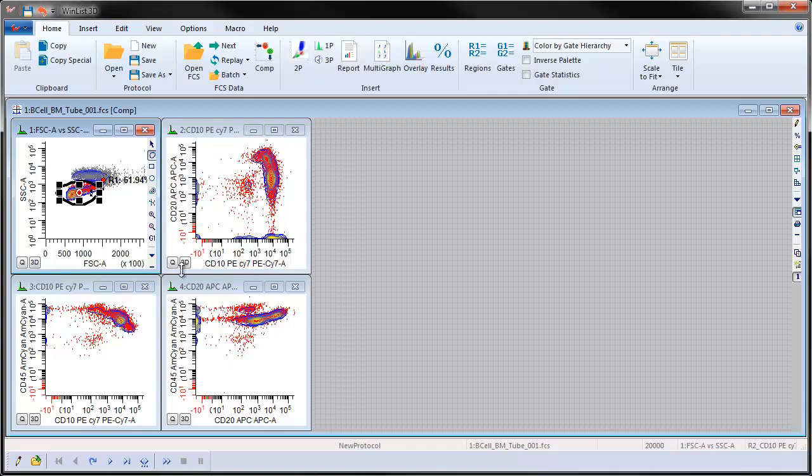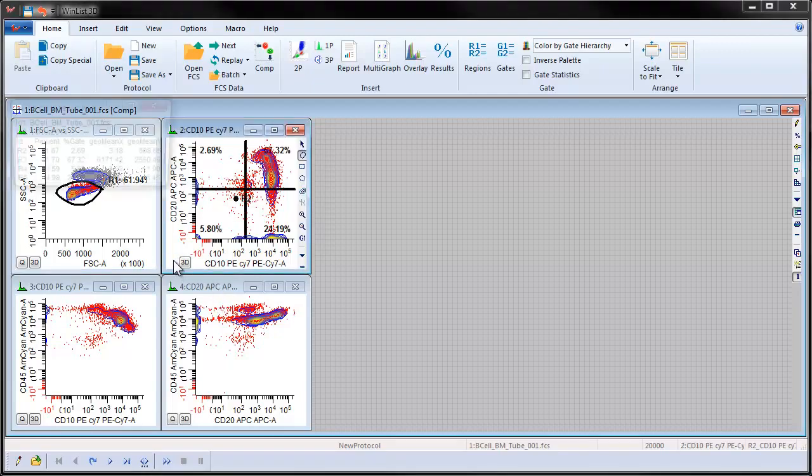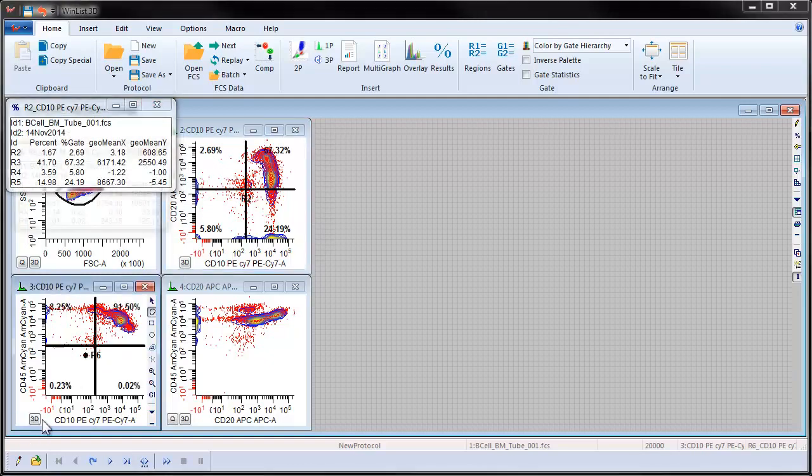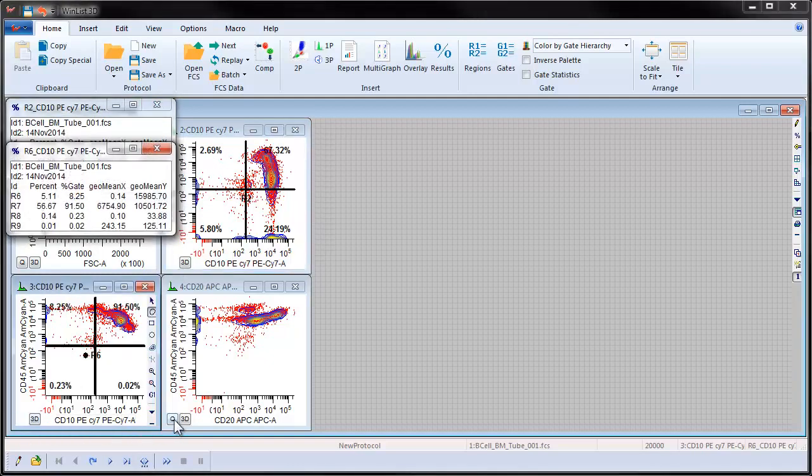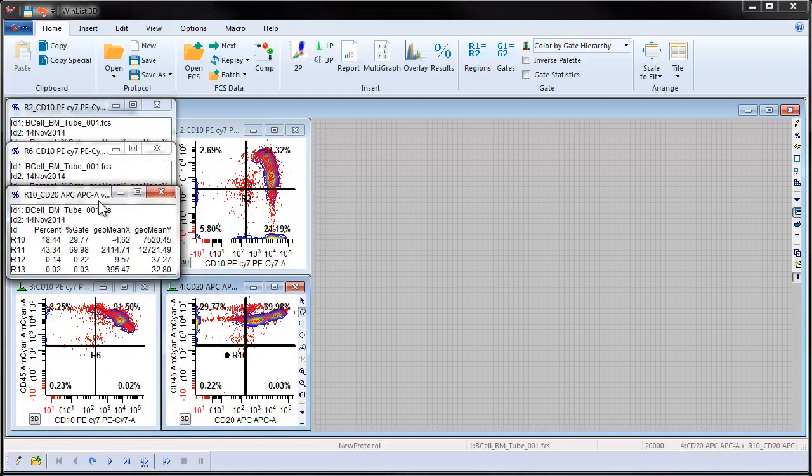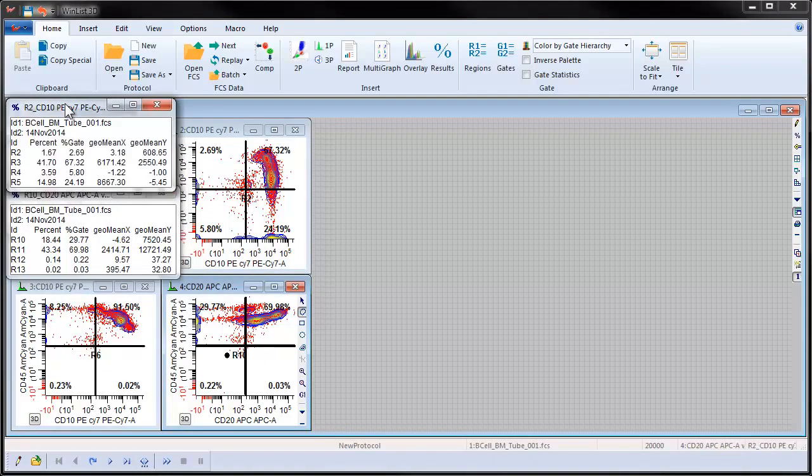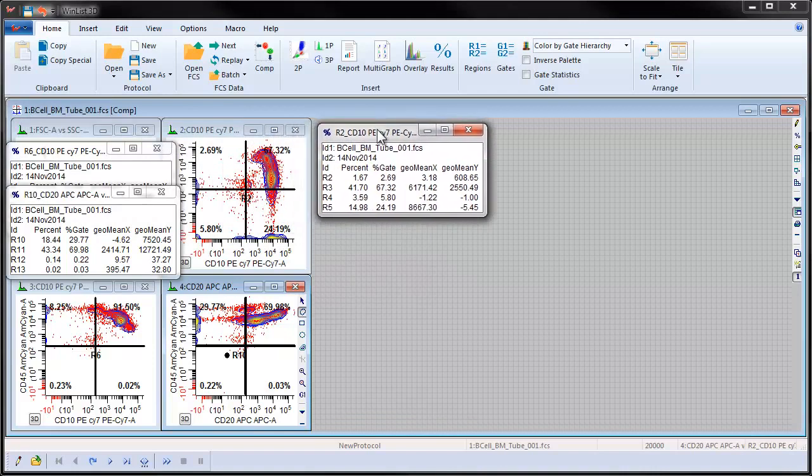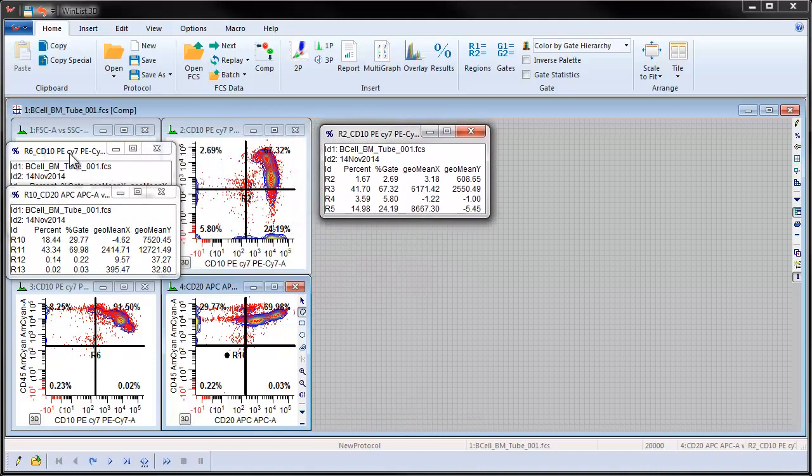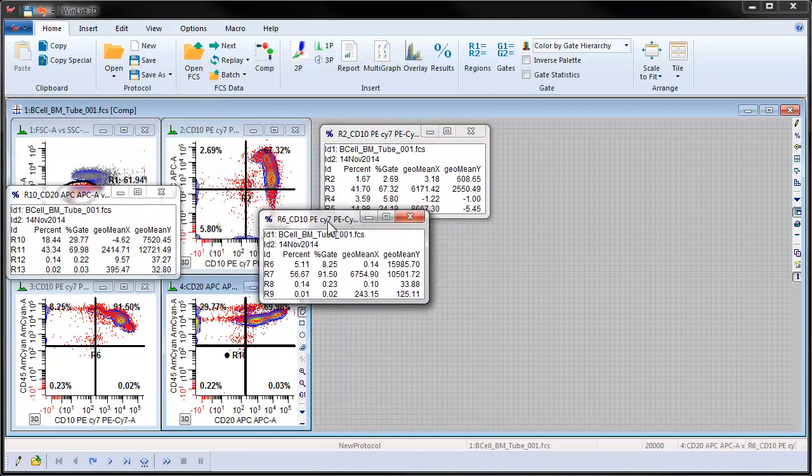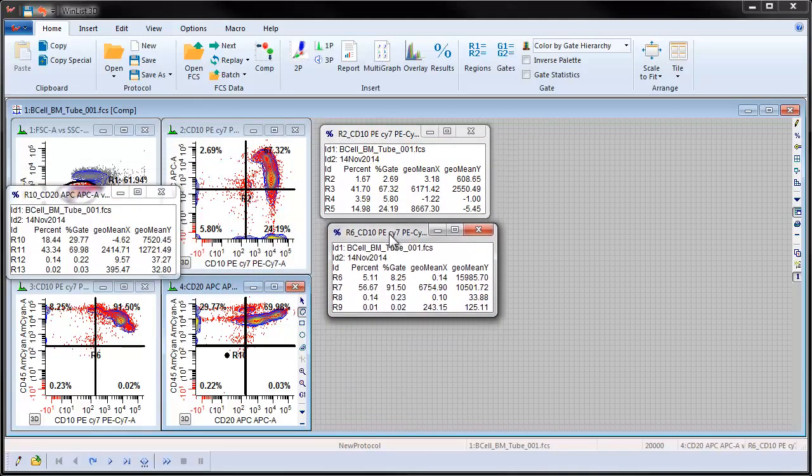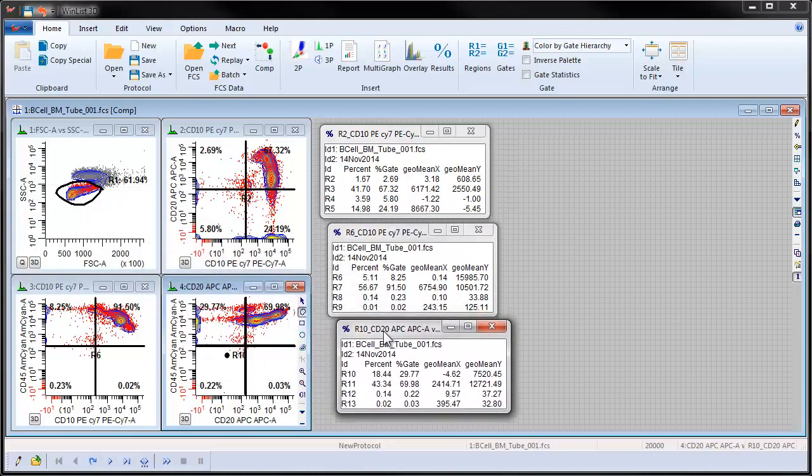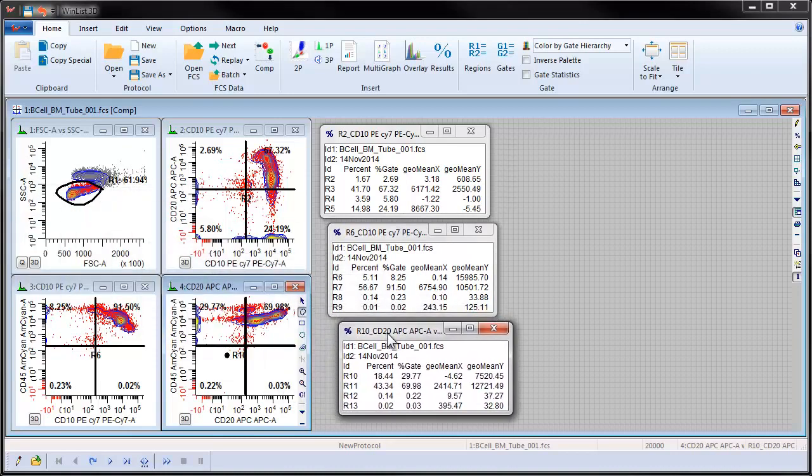Click the Q button, meaning quadstat, in the lower left corner of each of the gated histograms. A quadstat region will appear on each histogram and a results window for each quadstat will be displayed. Arrange the results window so that they are visible and not covering the quadstats.